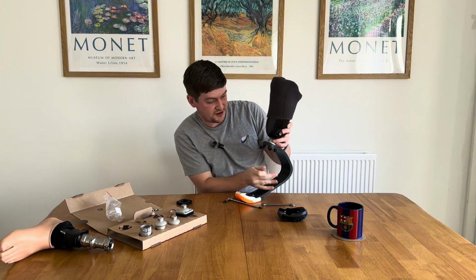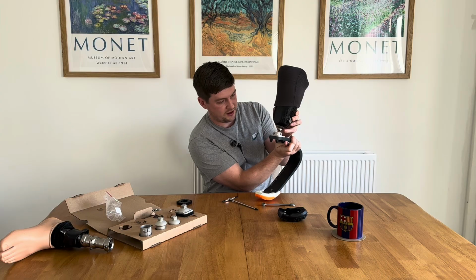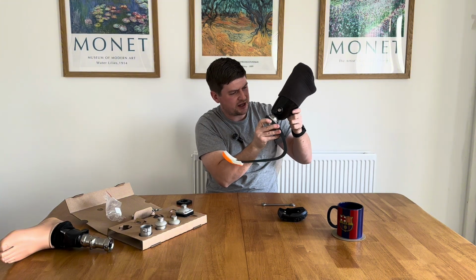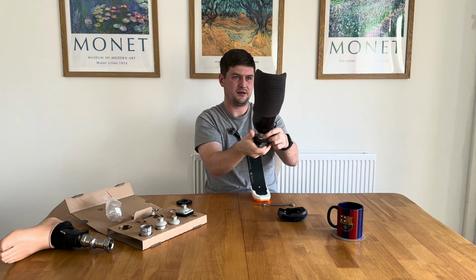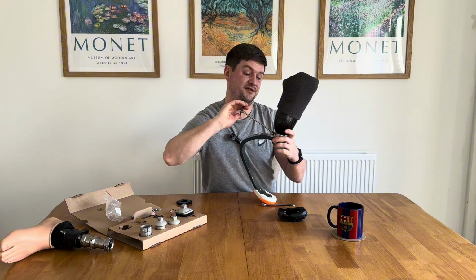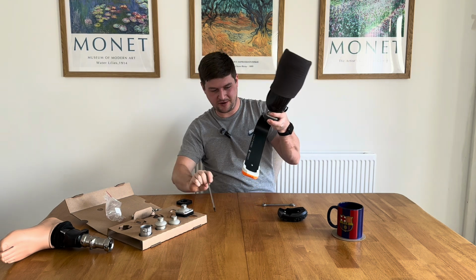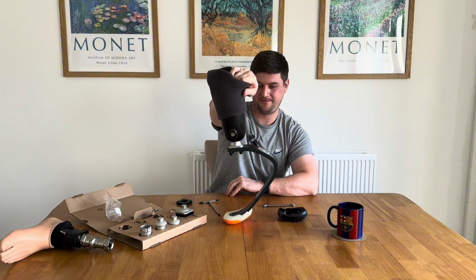And what I'm going to do is use the dirt markings and the hole markings there to try and position it in the exact same place as it was before. I'm just checking my line, see if it's still alright. It looks alright to me. Like I said, I'm hoping this is going to be pretty straightforward and I'm not going to have to adjust much. Right, so there's my running blade, which is pretty cool, I think.